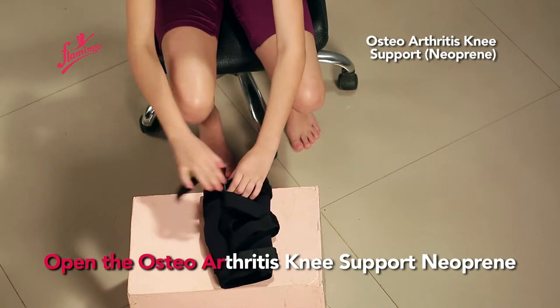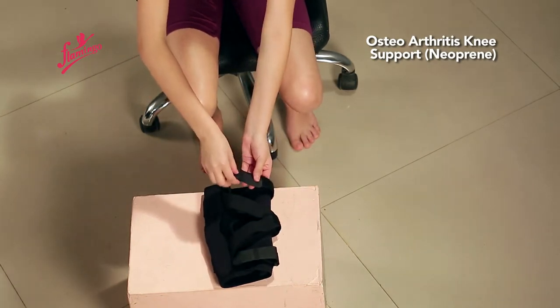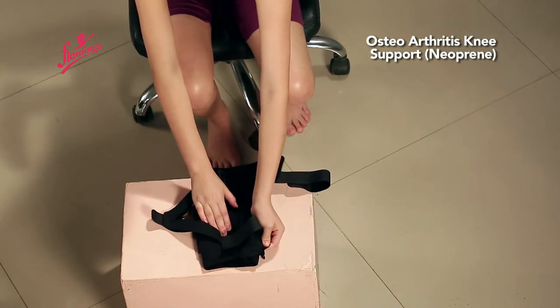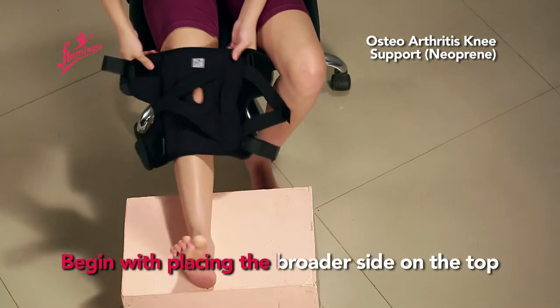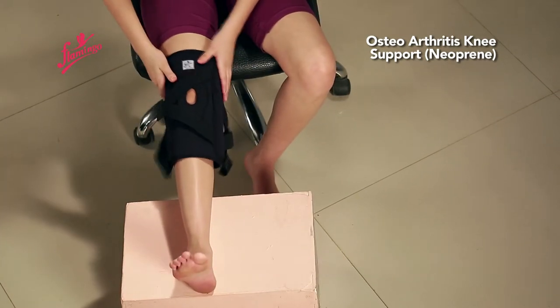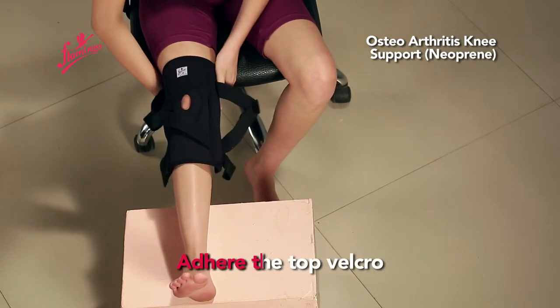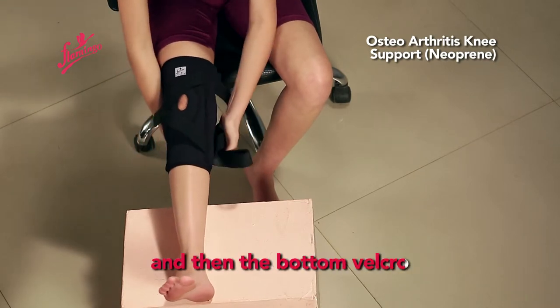Open the Osteoarthritis Knee Support Neoprene. Begin by placing the border side on the top. Position the patella in the patella opening. Adhere the top velcro first, and then the bottom velcro.